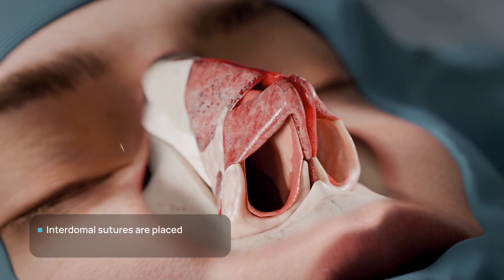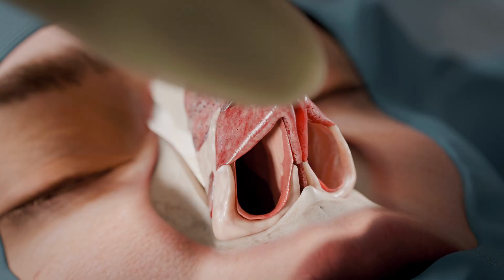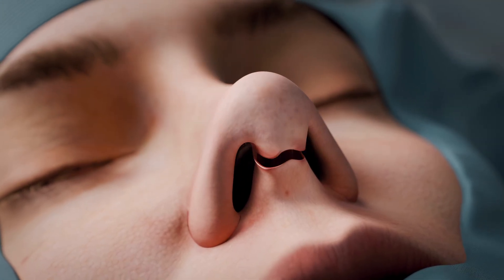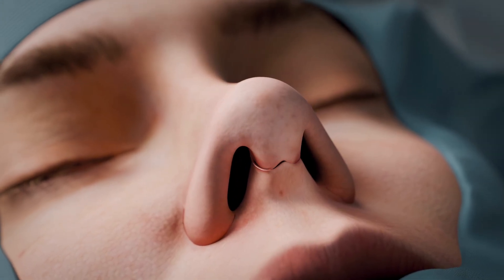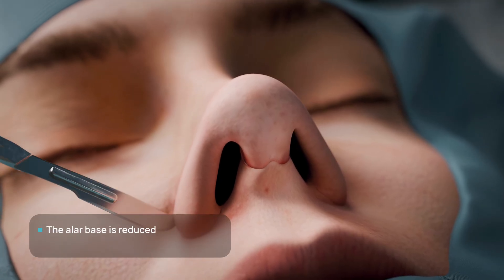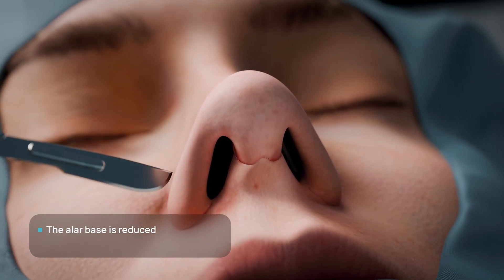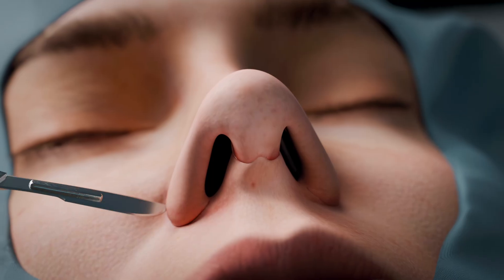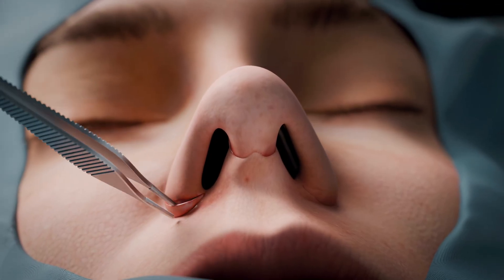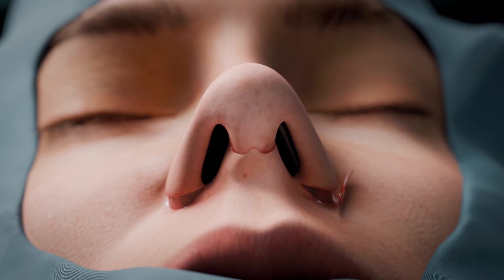The alar cartilages are then reshaped and sutured to define the nasal tip. Next, alar base reduction is performed by excising redundant skin and placing fine cosmetic sutures. This narrows the nasal base and enhances harmony in the lower third of the face.